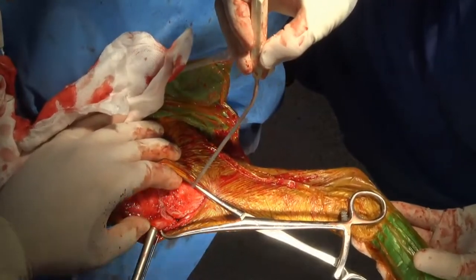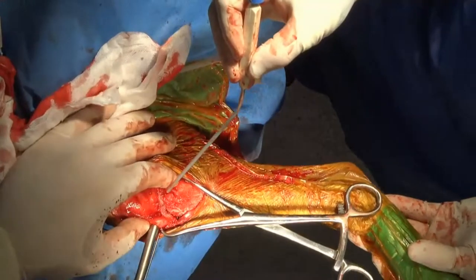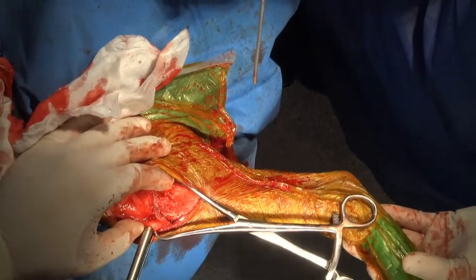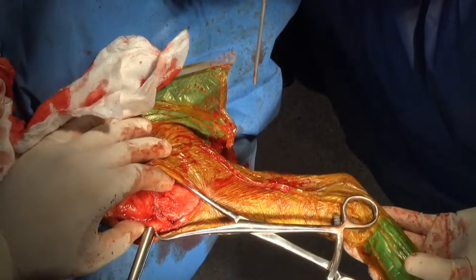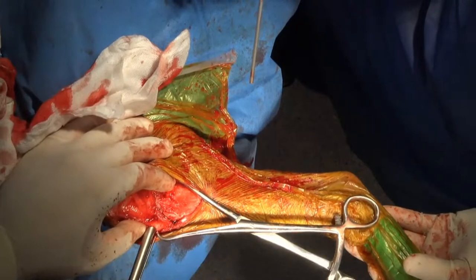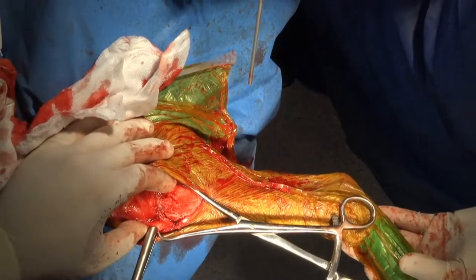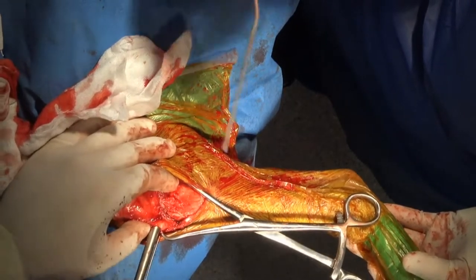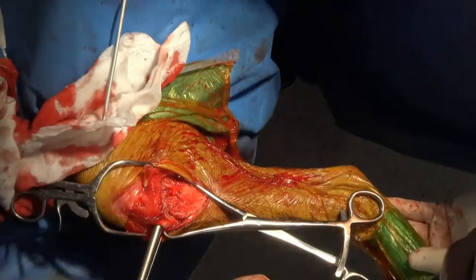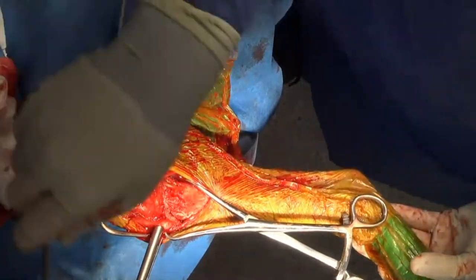And what we'll find as I tighten this up and get this against the bone, this is what's going to actually generate our compression. And what we often find is that you can see that really start to compress up as we tighten it up. Okay. So it should be pretty solid.